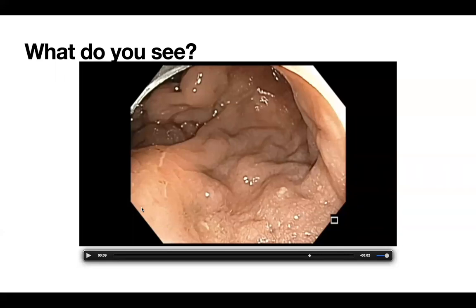So that's that. And then there is no NBI, there is no image enhanced. So at this point, the last part is that there is no retroflexion yet. I don't know what this mucosa looks like. It looks like what people call chicken skin, which signifies mucosa around neoplastic tissue. So I needed more information before doing anything.